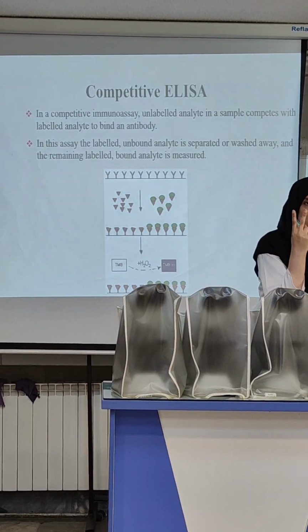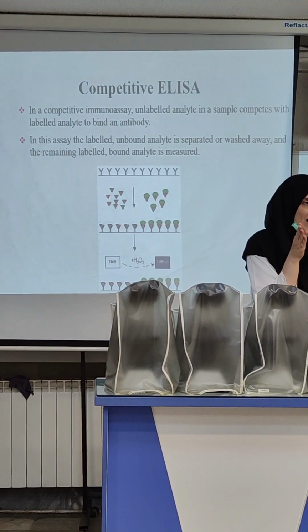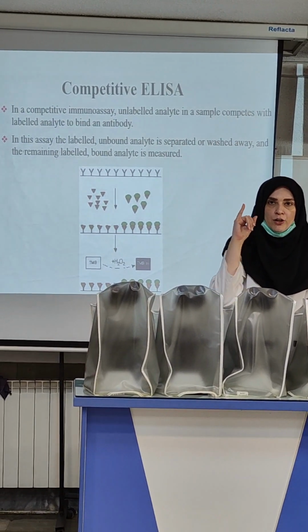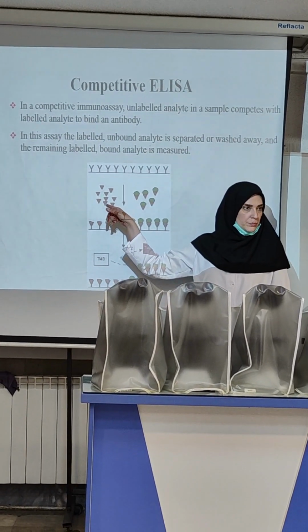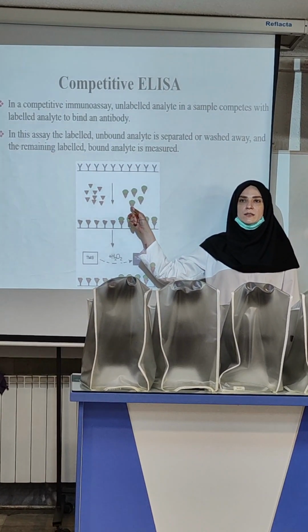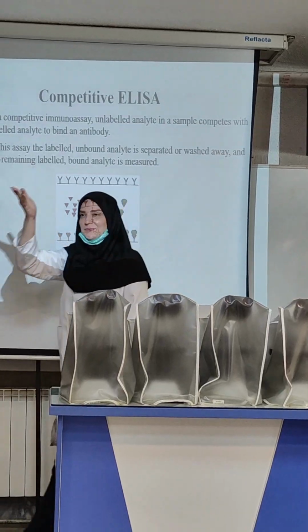You have two solutions for today's experiment. To each well, you added two solutions. One of them was for a standard. For the sample, you added serum. And what was the second solution? Conjugate.